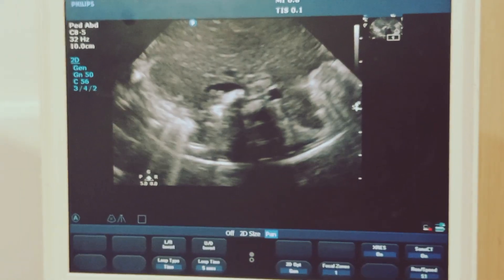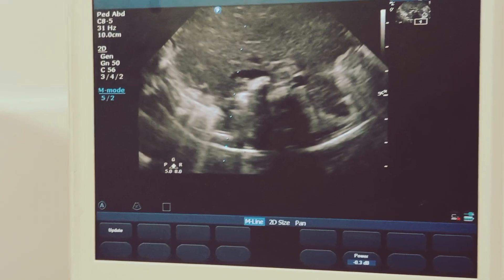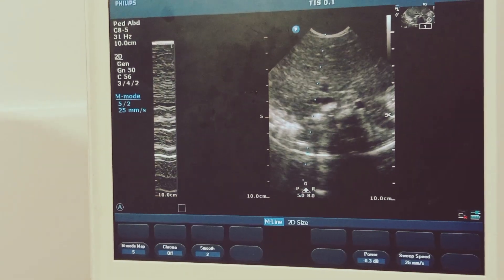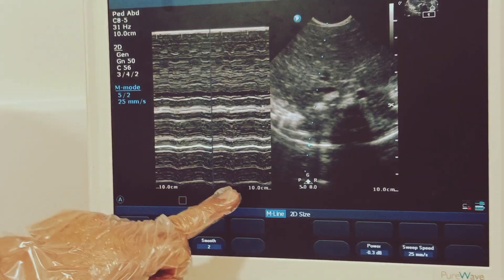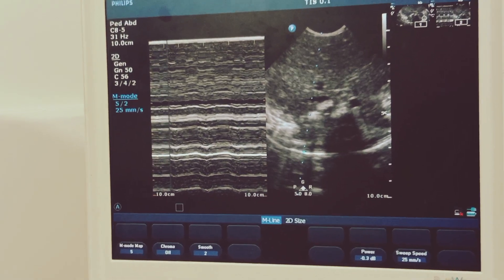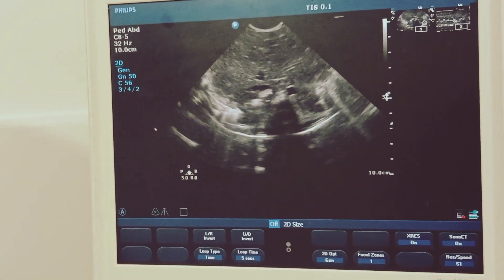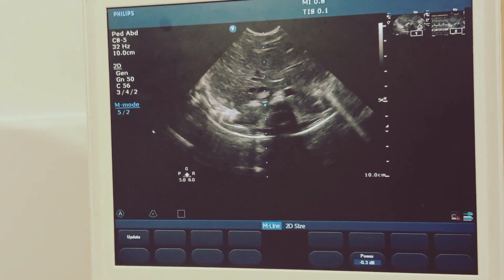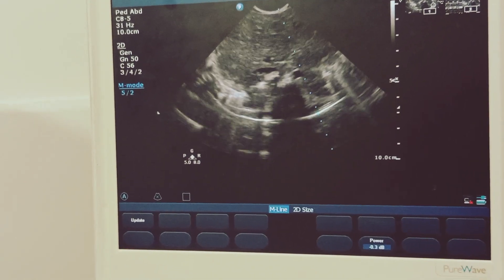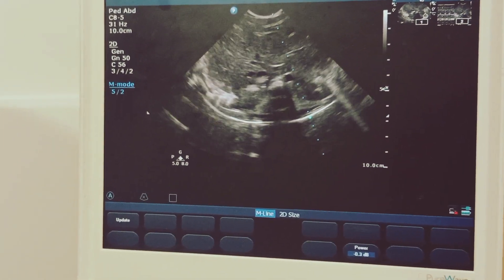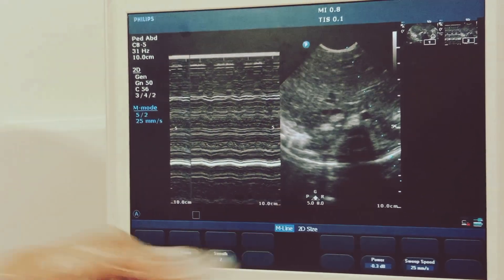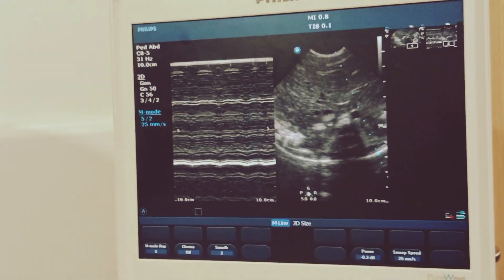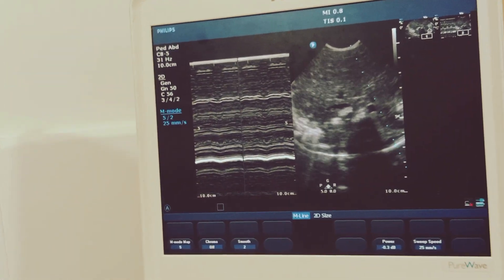How do we trace it? This is the M-mode. I will put the M-mode button there, then place it on the right side. You see the wave — this is called excursion: ascend, descent. I will record this, then do it on the other side as well. I take the M-mode on the left side and put it on the graph. Both are symmetrical, which clearly indicates the endotracheal tube is exactly in the correct position, with air entering equally into both lungs.